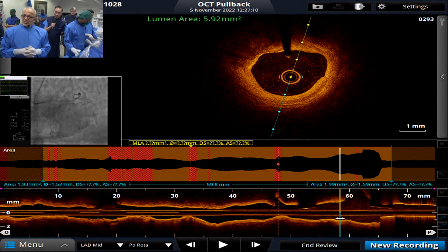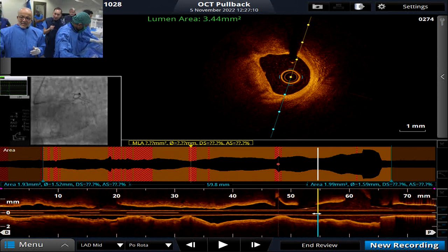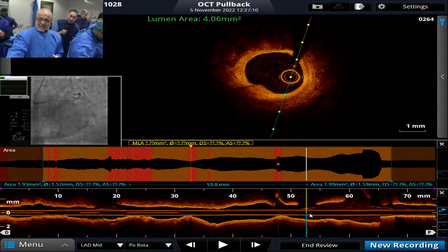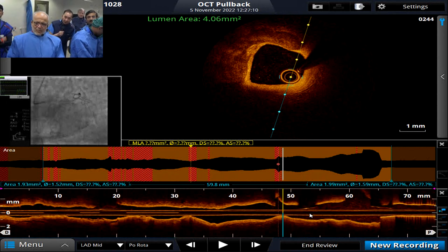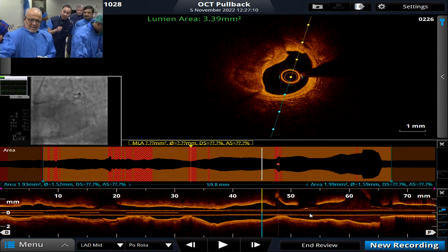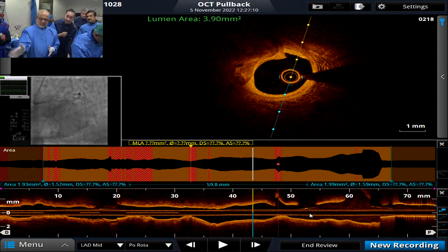Go. The calcium is not cracked yet, right? The calcium is still very intact. The calcium has cracked with rota. You can see those small cracks there. And you have seen balloon crack here also, yes. Balloon will give big cracks. But there doesn't seem to be big calcium. And there is a TCFA at 9 to 12 o'clock. Associated TCFA along with calcium. Go.